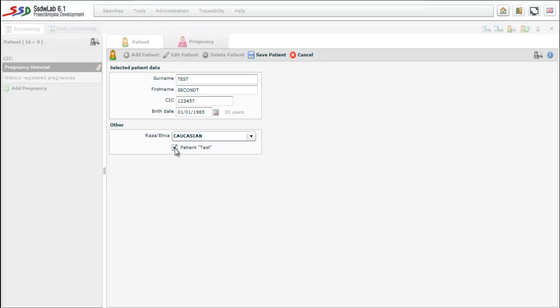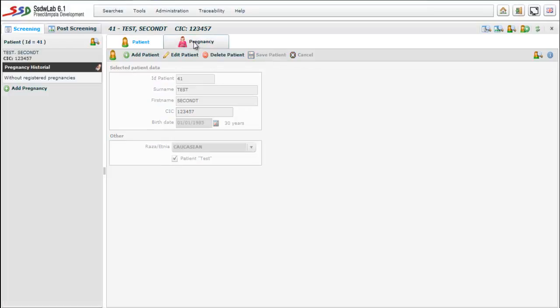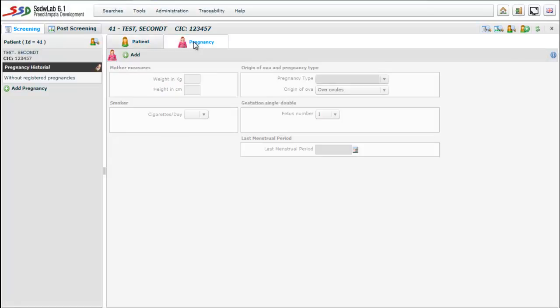We mark the patient as a patient test. The option patient test makes that all information relating to this particular patient and its screening is considered by all program options as a test. So this screening will not influence in the quality controls and will not intervene in statistical calculations.